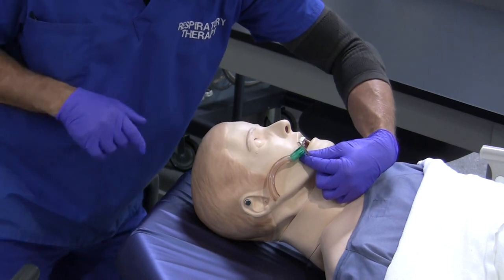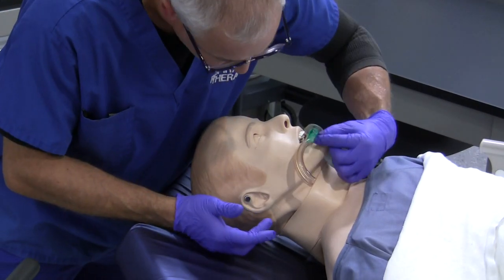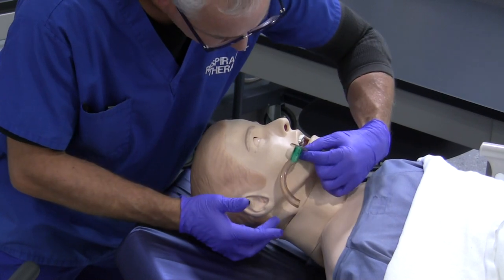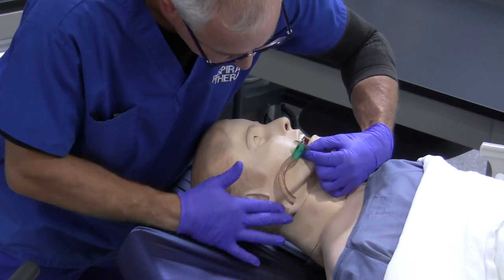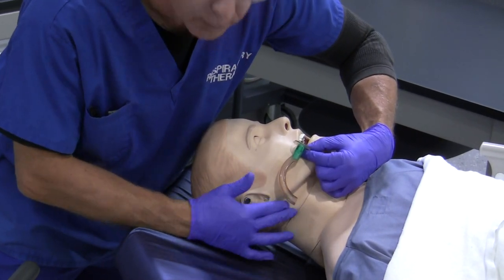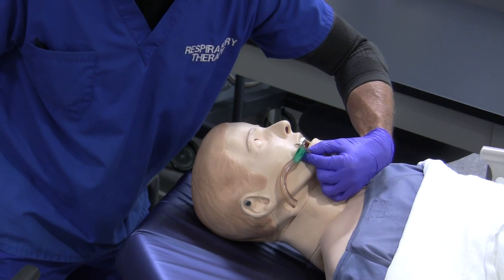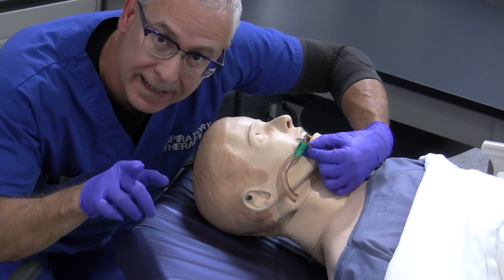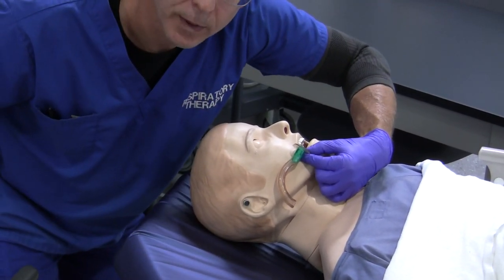Another way to size the OPA is to place it from the corner of the mouth to the angle of the jaw and see if the airway extends roughly two fingers or two centimeters beyond the angle of the jaw. If it does, it's also the correctly sized airway.